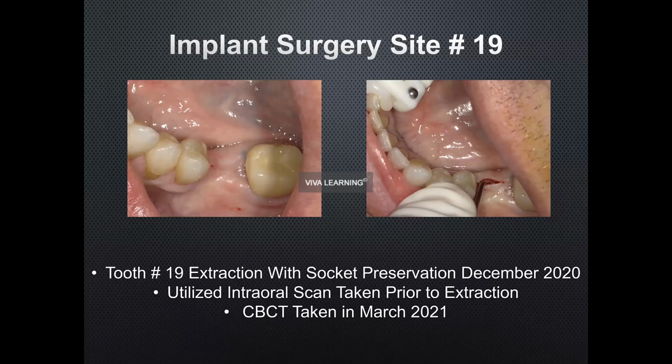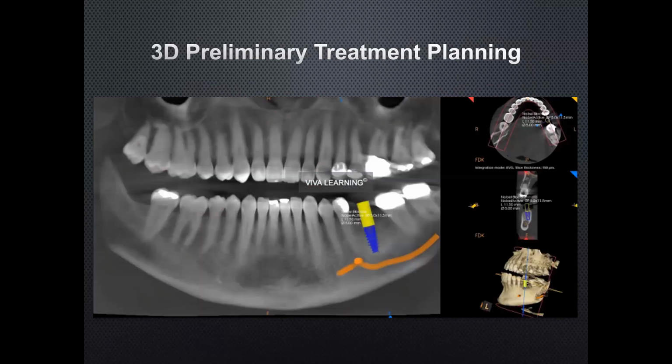So we took a CBCT in March after 3 months of healing. In this case, it's just the preliminary treatment planning on the CBCT software. We placed a Nobel 5 by 11.5 Nobel Active in this site.